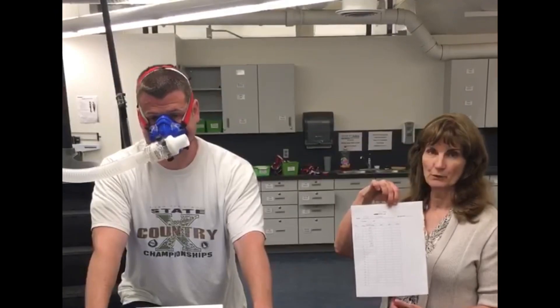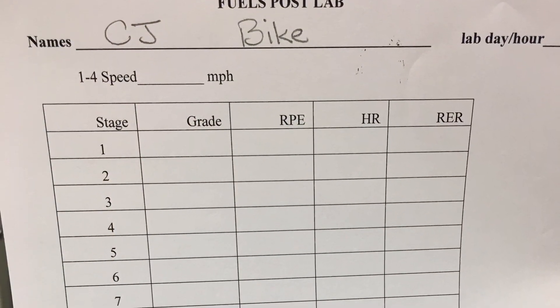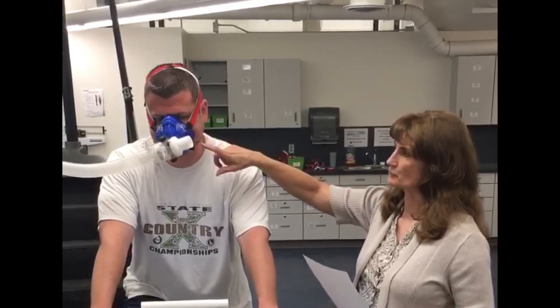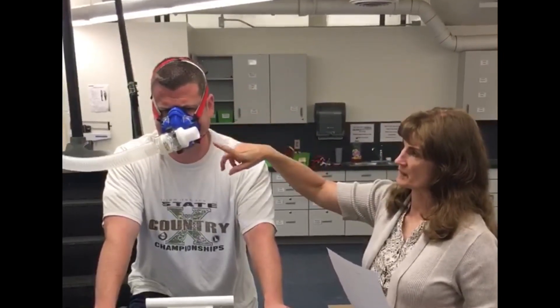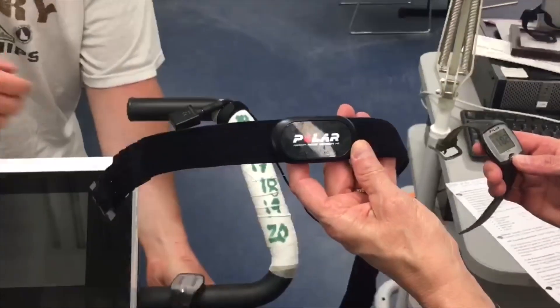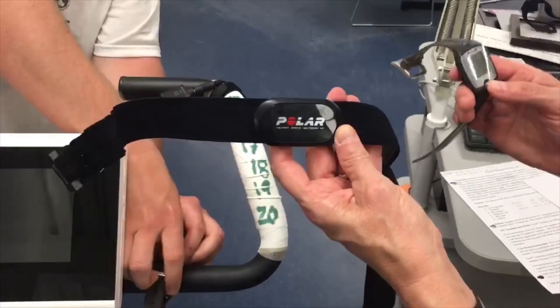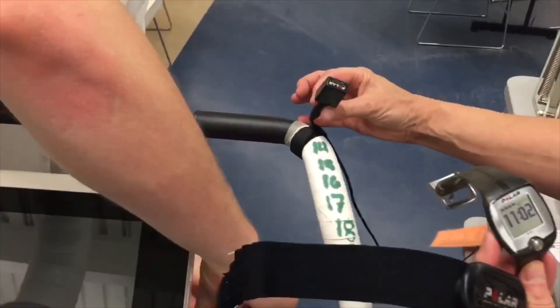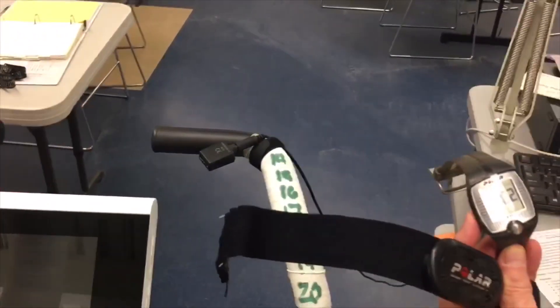For this test, we're going to show you this data sheet that we're going to be recording our data on. We've used the mask with the CarboMed system. We're using the rubber mask instead of the mouthpiece, along with the headpiece, and then we have the T-valve setting and the tubing that goes into our metabolic cart.